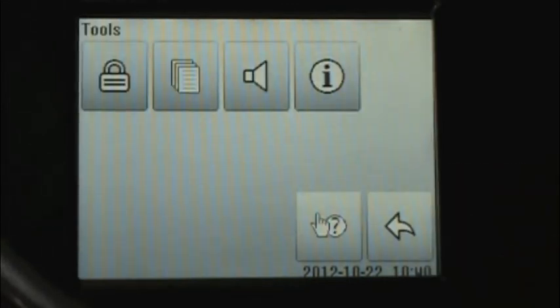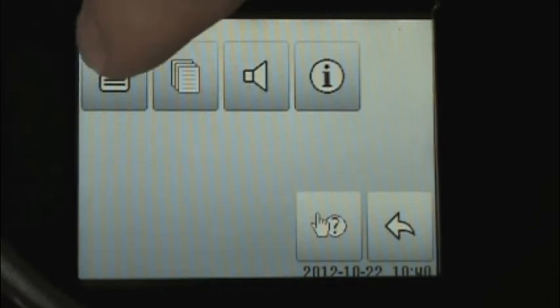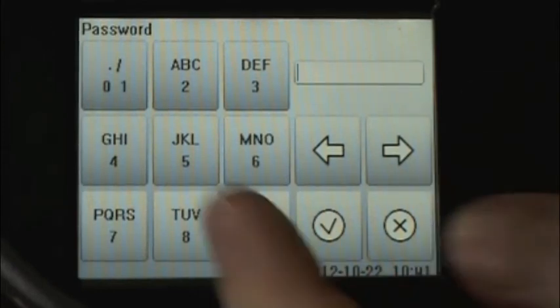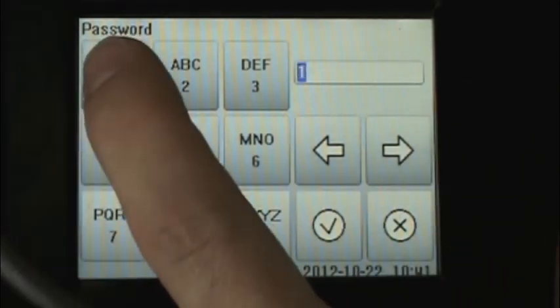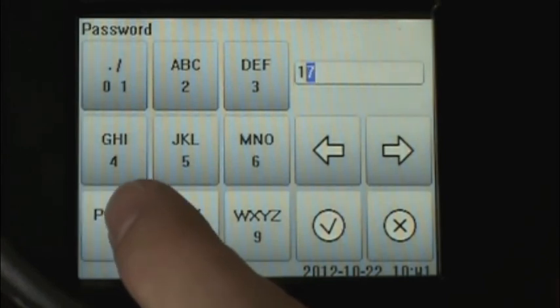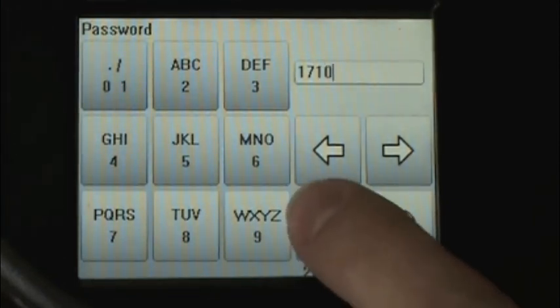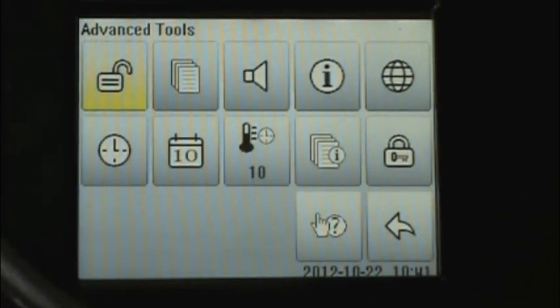Here in the tools menu, we see four icons: a lock, documents, a speaker, and information. Unlike the previous incubator, the Model 1710 does have password protection, so certain aspects that we wish to program can only be accessed by a person who knows the password. When touching the lockbox, we'll be prompted to enter our incubator password. For this demonstration, we've selected 1710 as our password. I click the check mark, and now I have access to the advanced tools menu.